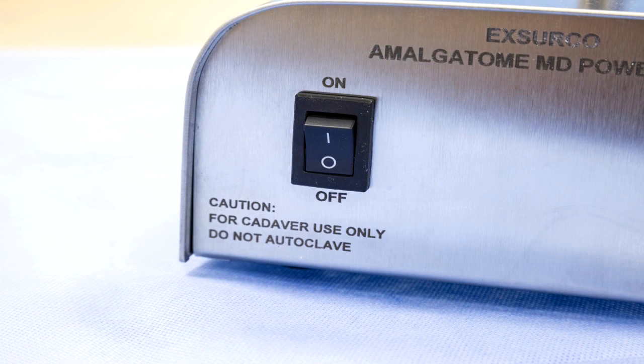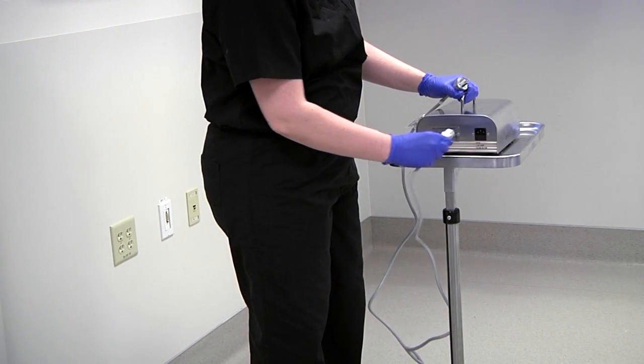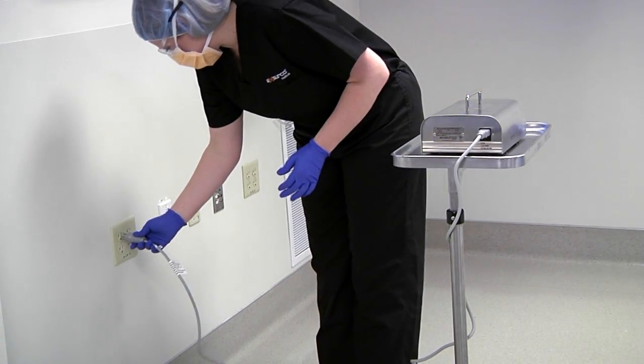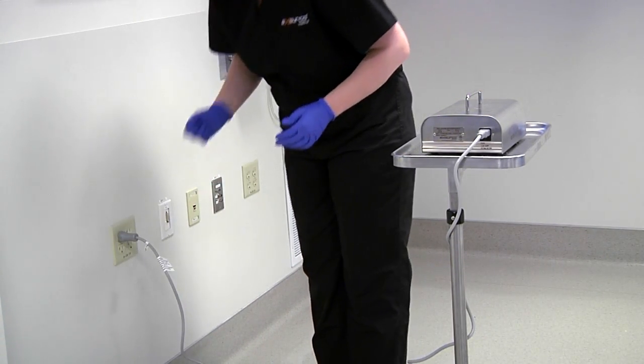Make certain the power switch is in the OFF position. Connect the power supply end to the back of the power supply. Connect the power supply plug end to the electrical outlet.